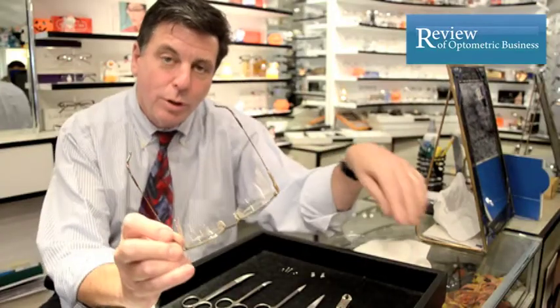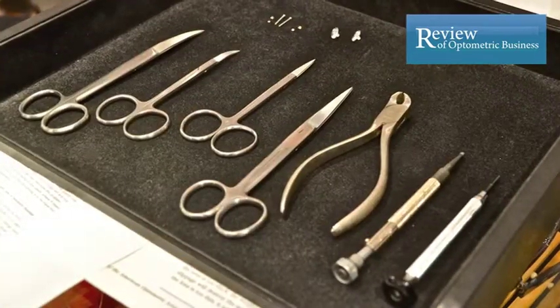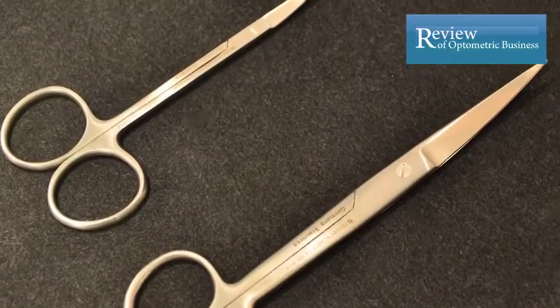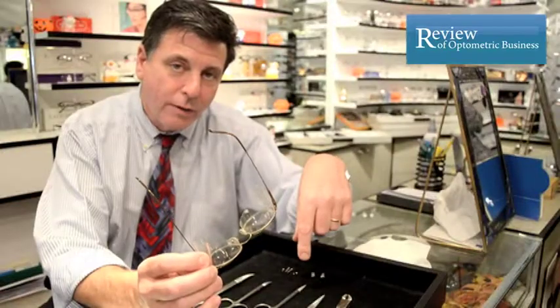In producing a pair of moisture chamber glasses we use all these tools: a screwdriver, a hex nut wrench, a chapelle plier, and some scissors. The scissors help you to contour the plastic onto the patient's face.